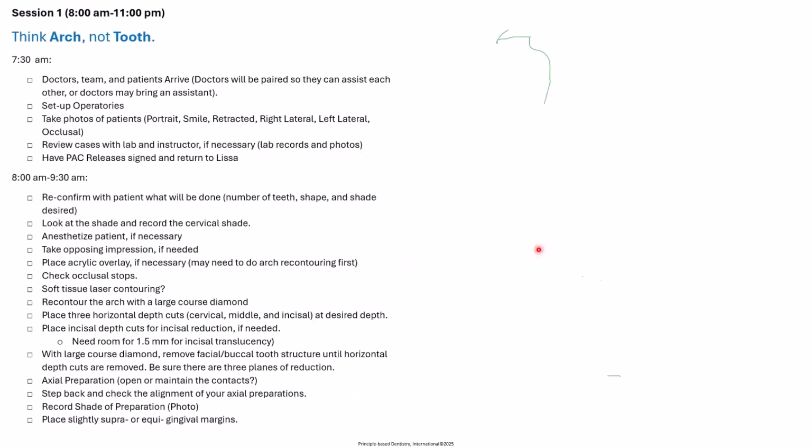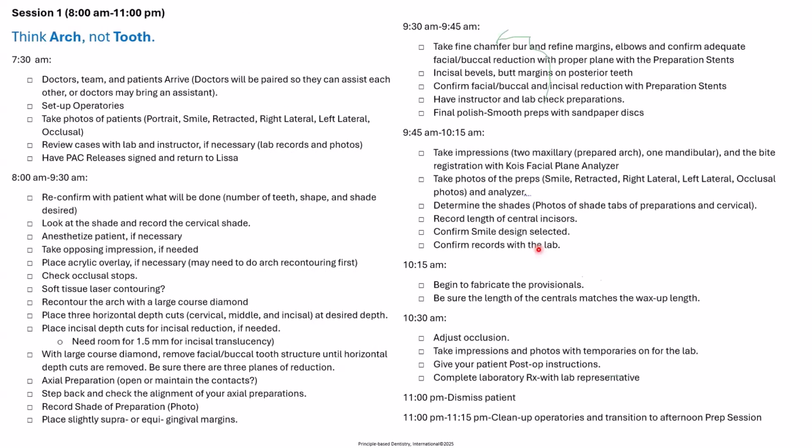Unlike how a lot of us do our traditional dentistry, where we might prep out one tooth, and then let's say we have a tooth on the other side of the arch, then we prep out that tooth. Well, in this case, we've got 10 teeth and we're going to prep them out like they're just one big tooth. That's a little bit of a technique change for some of you. But I just want to show you that we have everything mapped out when it comes to the prep session and to the cementation session.